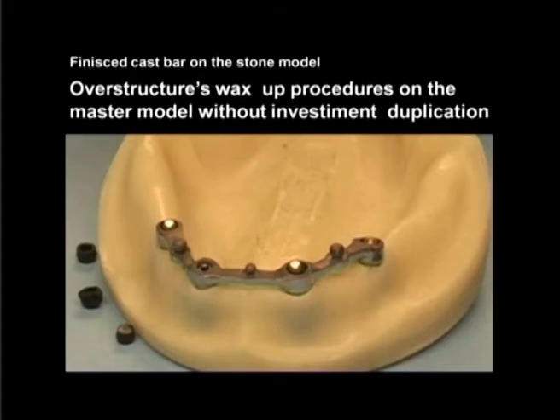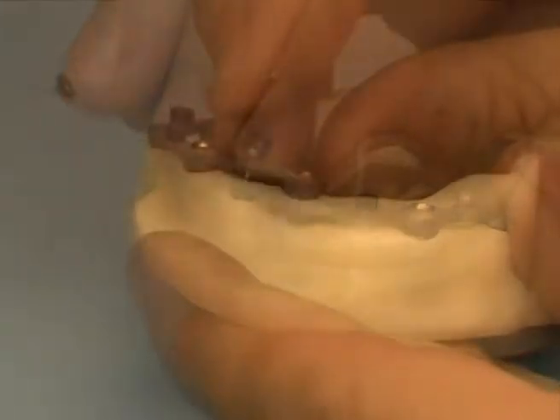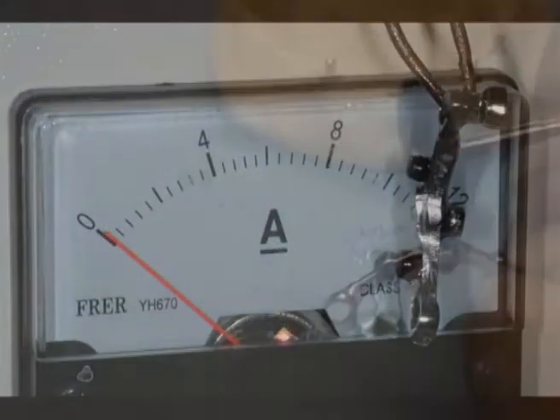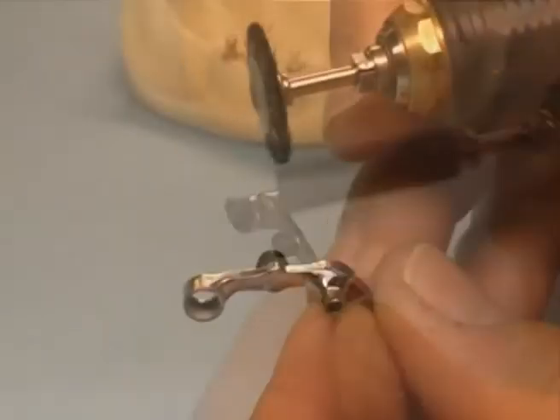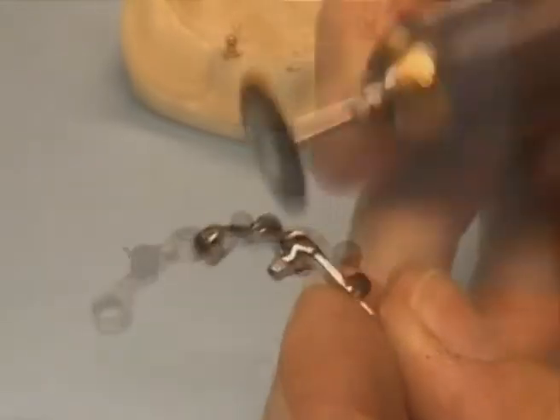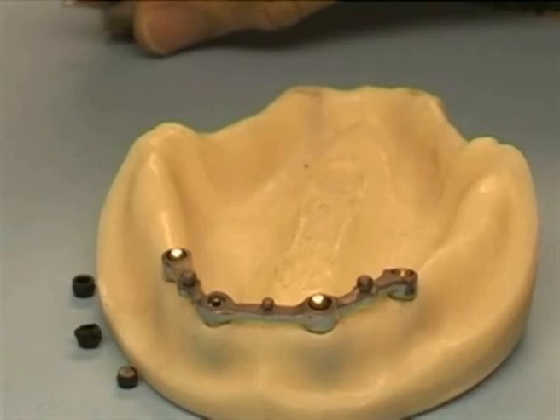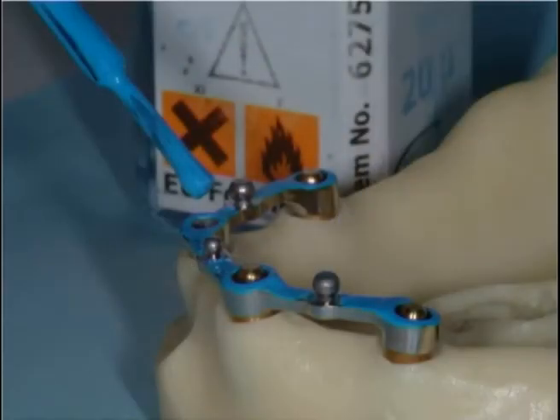Remove, snap on the black caps again, and proceed with electropolishing. Finish refining and polishing of the cast structure on the sides and lower gingival surface using rubber burrs and brushes. Do not polish the occlusal surface. It will be done later on in order to create resiliency, which eventually can be increased by creating an extra layer painting over with enamel.